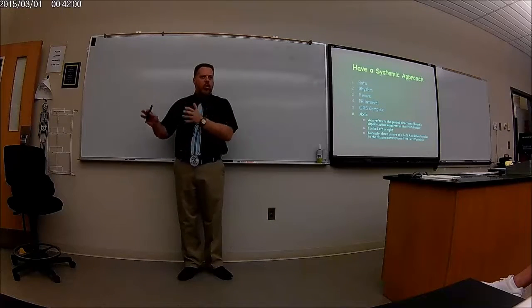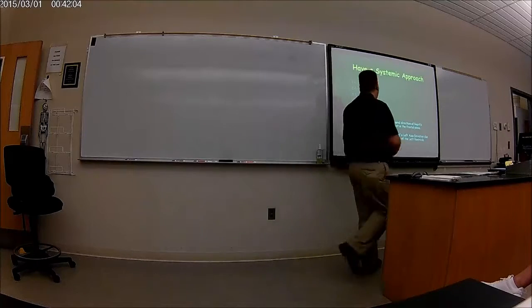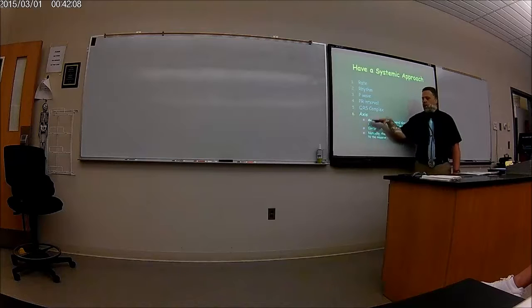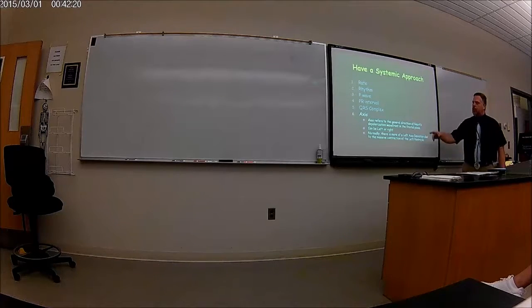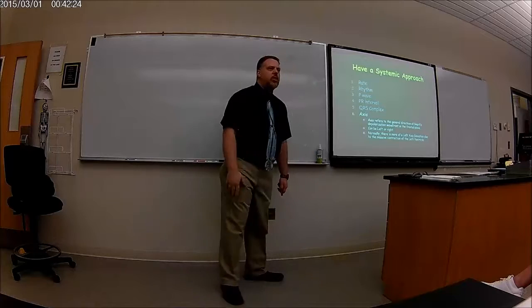You can actually see right or left congestive heart failure. Now, I'm not going to go into all the details here. I'm more concerned with the first 3 or so. But over here, if you need to go further into this, because I do have students who are in nursing and they want my EKG stuff because they're going to ask questions on it, so they need something basic. But what I'm going to show you is basically the first 3 things on here. That's all I expect you to know for the exams.